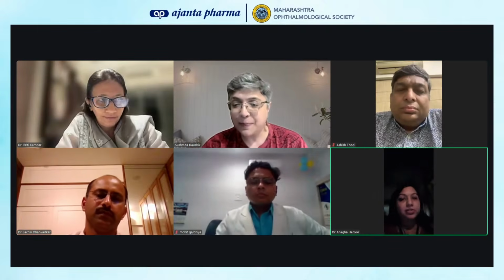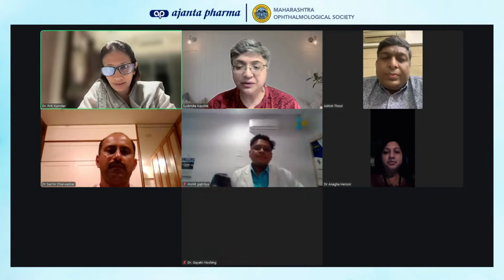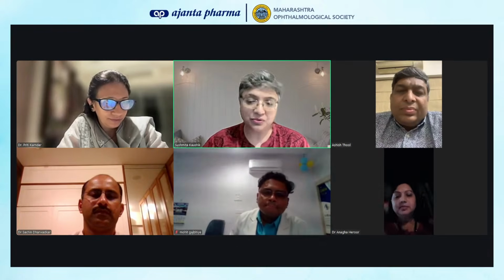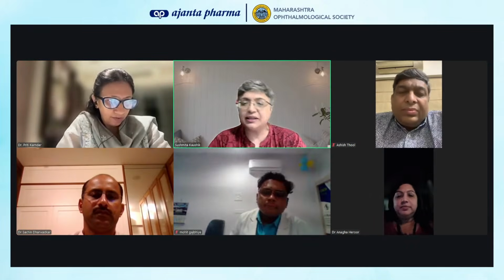Are all the other panelists also using it? So far, no. No, you can offer it. You can say that they now can, it's possible. You can talk to somebody who's doing it and it's possible, and we can stratify risk. It takes a huge burden off their heads.